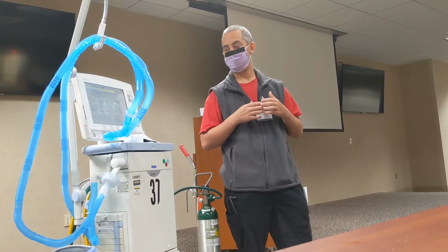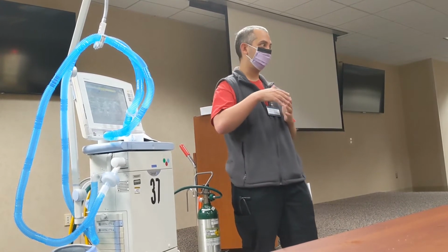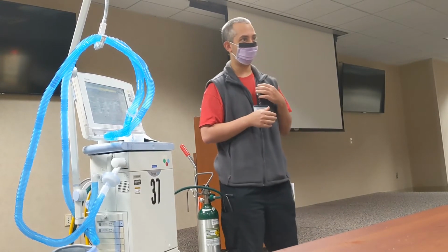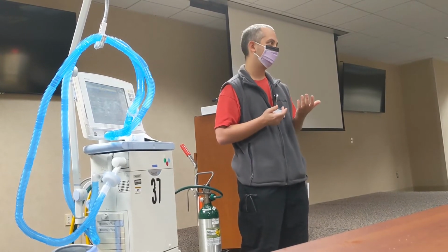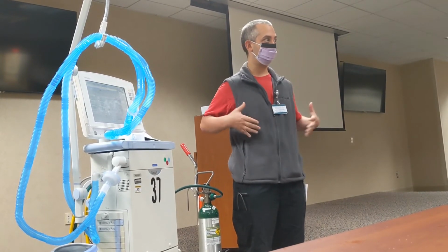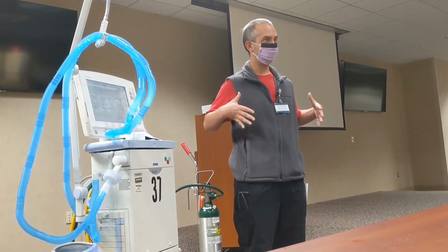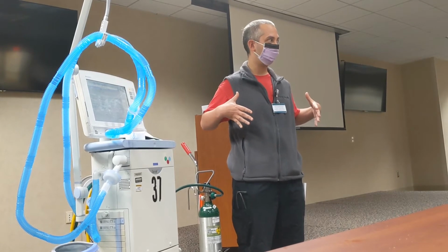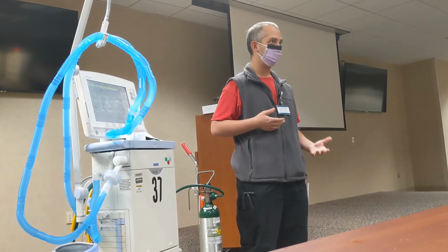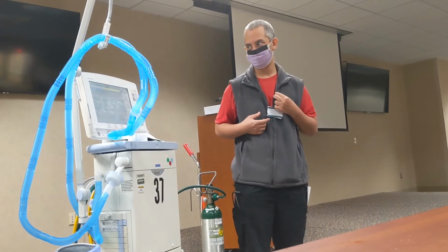And then also, you may need to adjust your P high a little bit higher or a little bit lower, and that's going to be based on your needs for oxygenation and ventilation. Increasing your P high, you're going to have higher pressures in the lungs, basically trying to recruit more lung. The more lung you recruit, the more oxygenation, the less VQ mismatch, and the better your oxygenation should be.